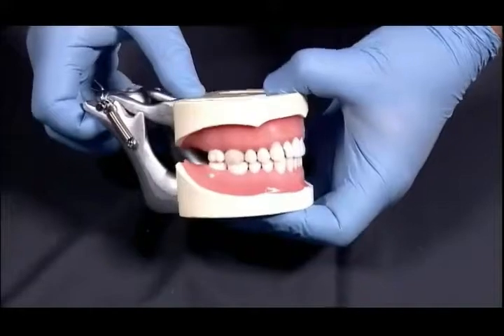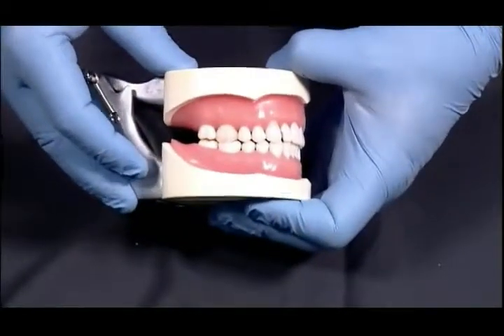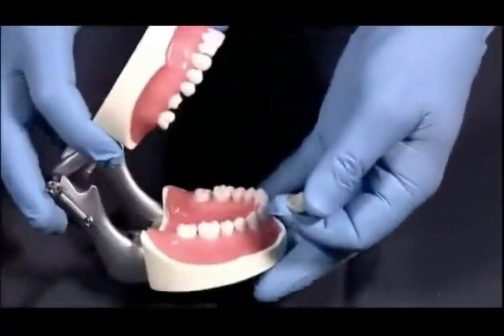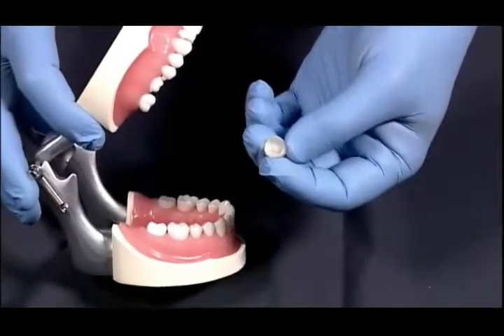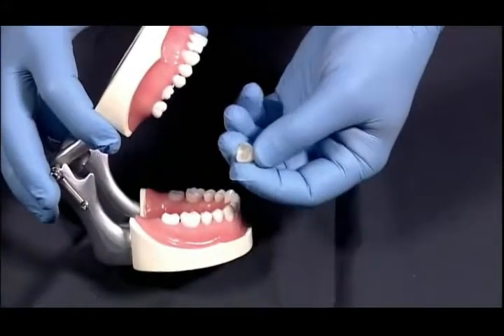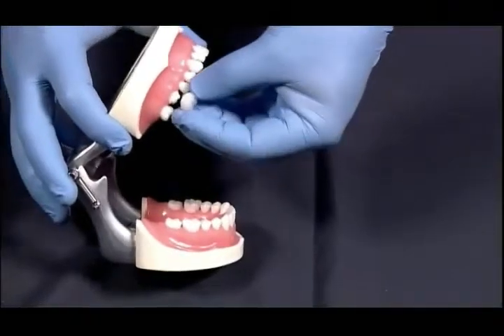So there we are on the patient. You'll test it in, check your interproximal contacts, make sure that they're fine. From here, your assistant can call you. You can come back into the room and you will bond this to the tooth or cement it to the tooth using any of the good new dual cured resin cements that are on the market. That's it. That's a crown in a single appointment.